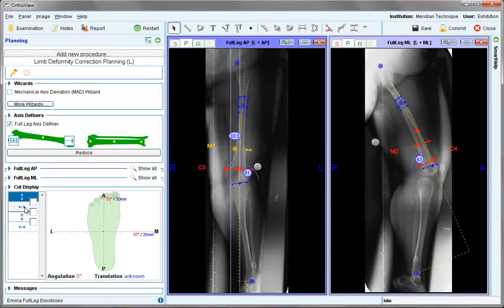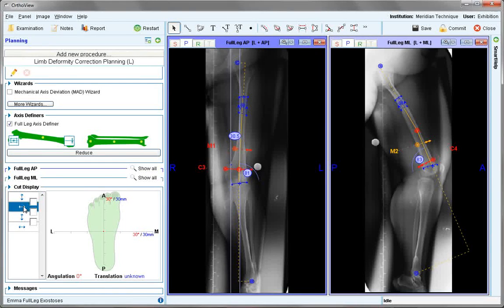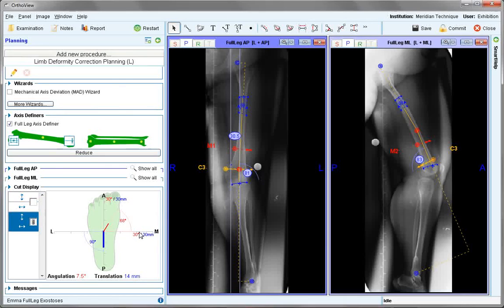A cut display can be shown for the different cuts, and in both views they can be linked. As each one is selected, it is highlighted in yellow. The oblique plane vector diagram shows the overall angulation and translation for the two cuts joined together.